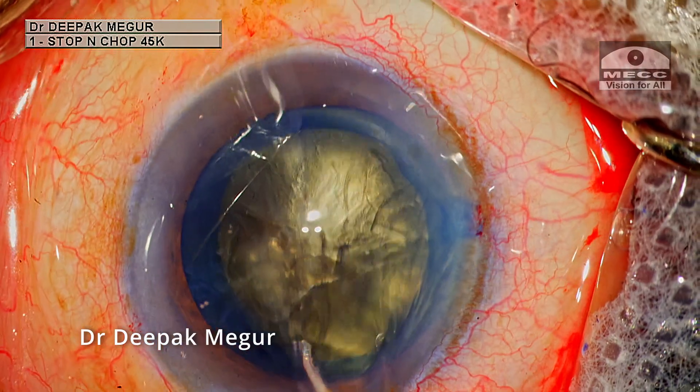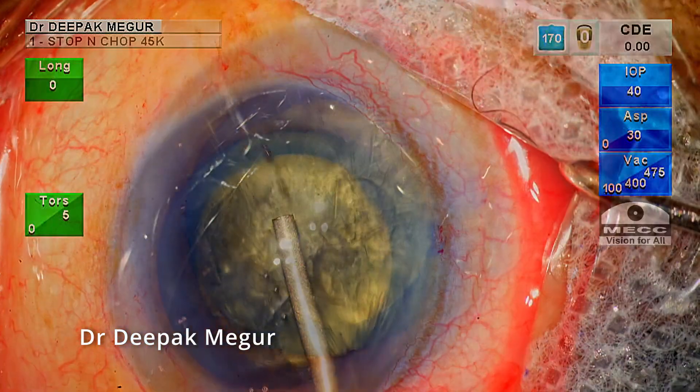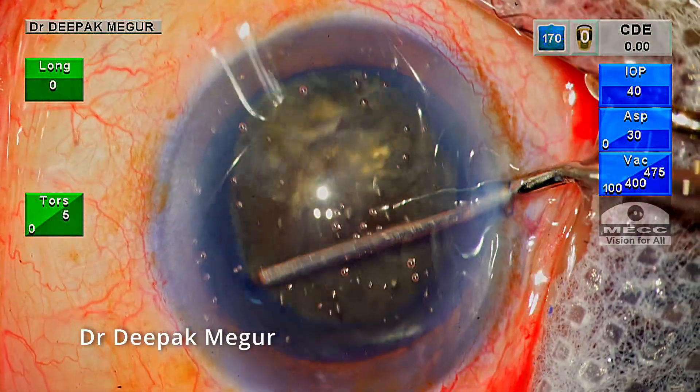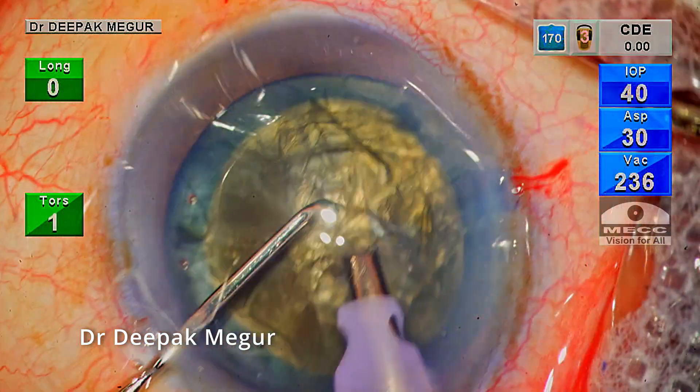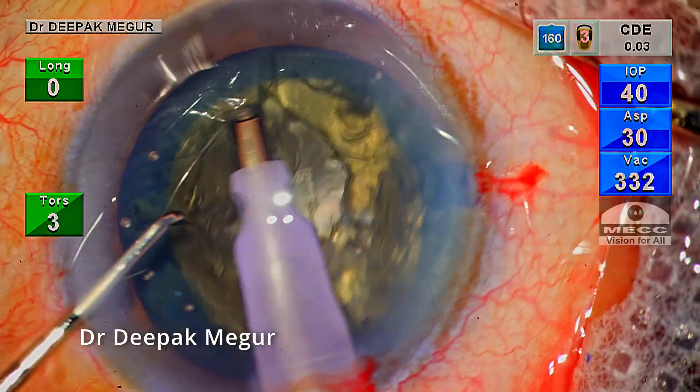A gentle hydrodissection is performed followed by decompression at multiple quadrants. The nucleus is rotated. Now please take a moment to note the energy consumed — it's zero obviously — and let us see how much energy is consumed by the end of the procedure.